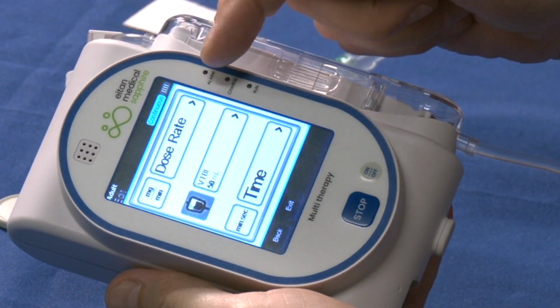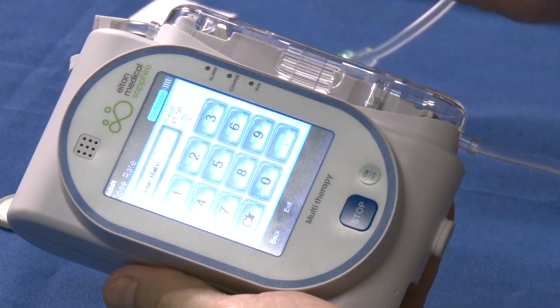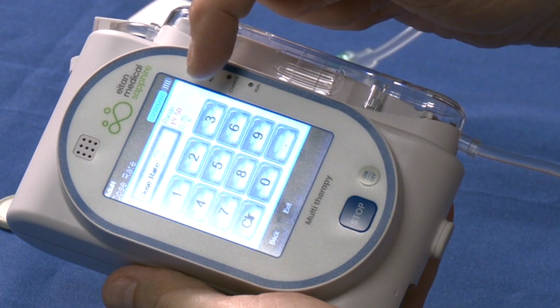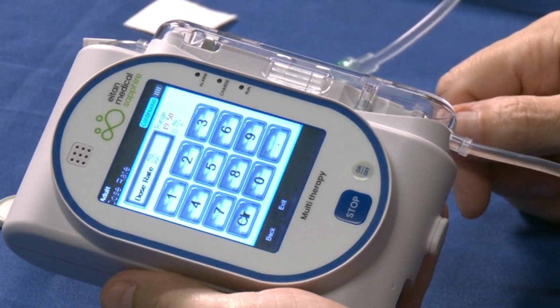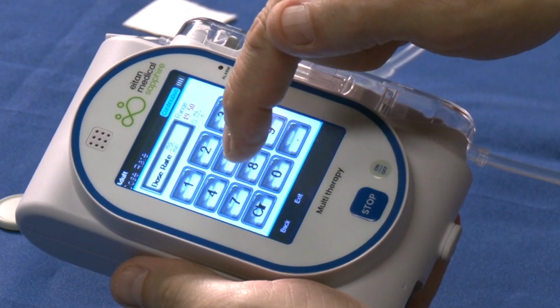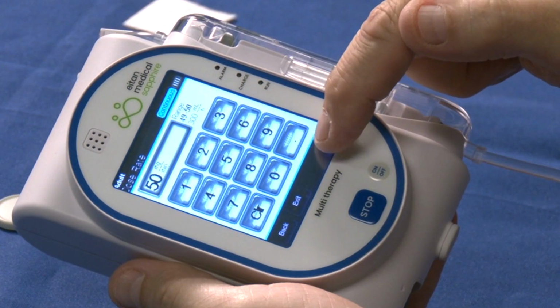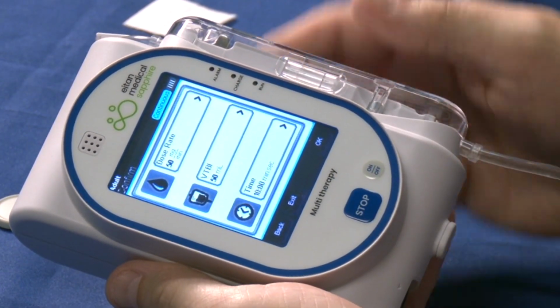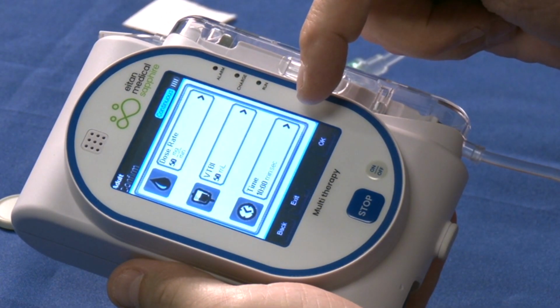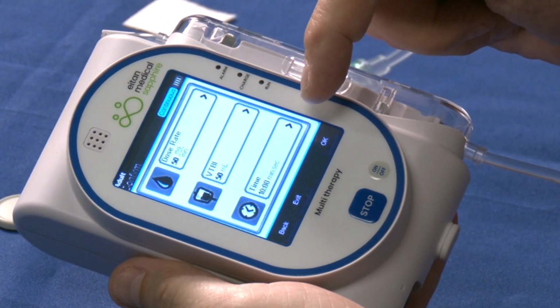Select Rate. Per EMIHS, we always select a number in red on the right-hand side. For this example, type in 50. Select OK. Notice the time of our infusion is auto-calculated out to 10 minutes. Select OK.